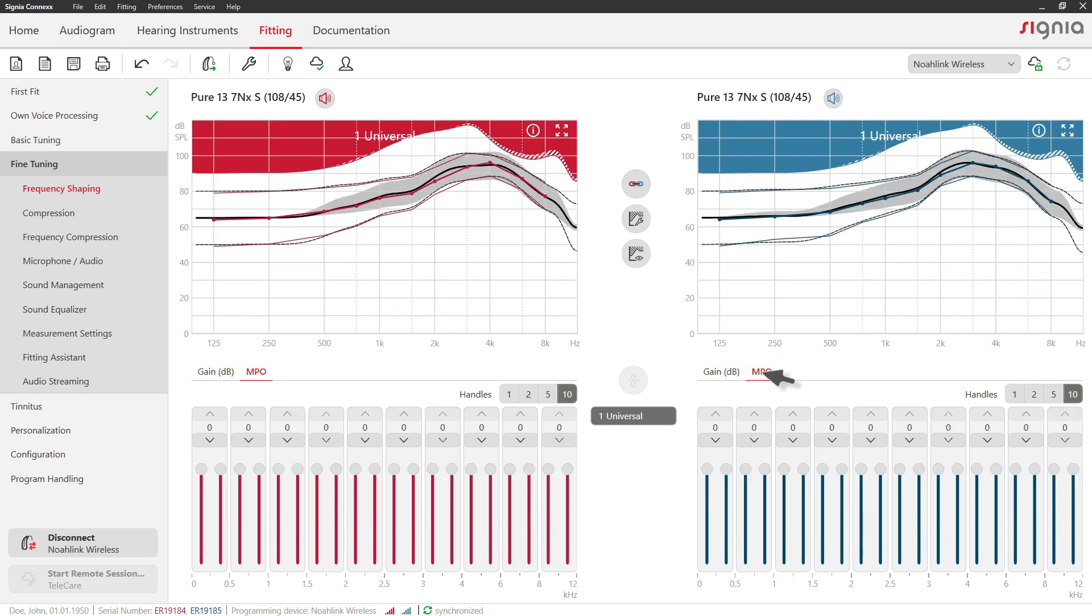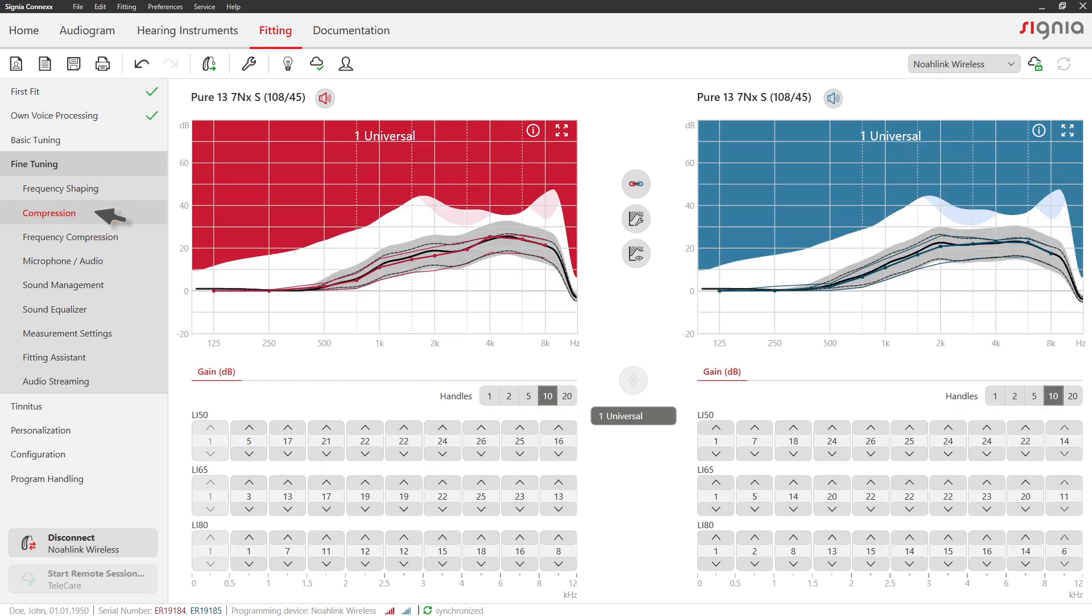In the Compression menu, you can directly adjust level dependent gain settings.